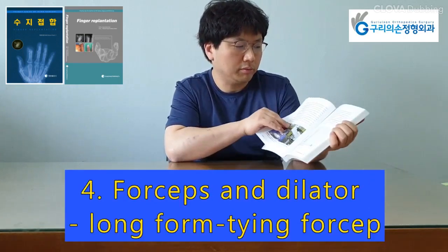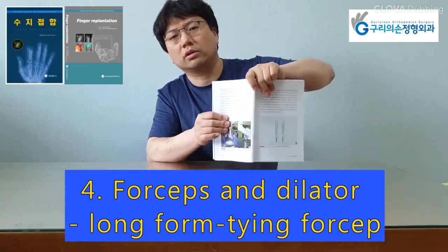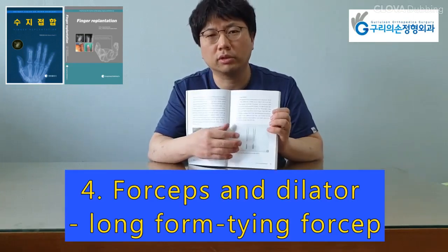Commonly available forceps can be divided into toothed and non-toothed varieties. They are also available in different lengths — short form and long form.